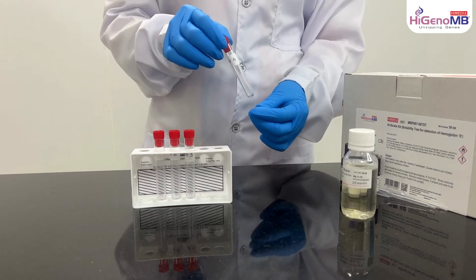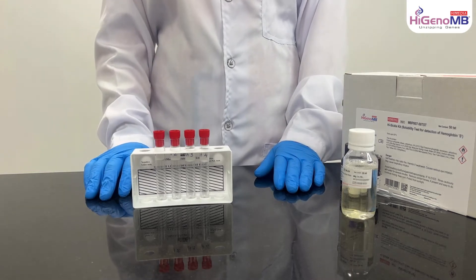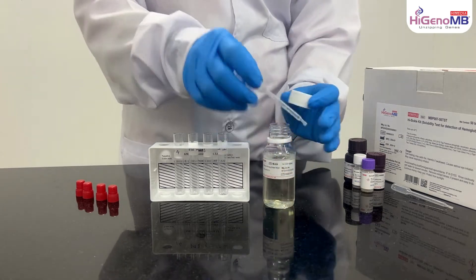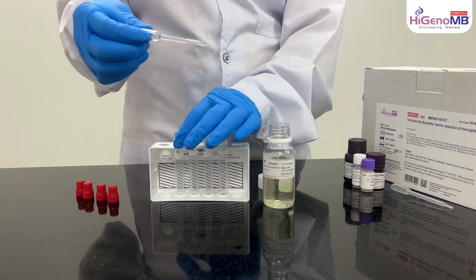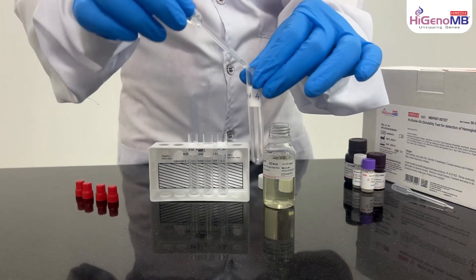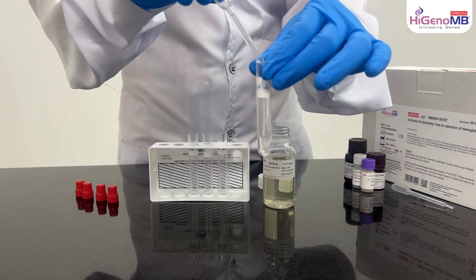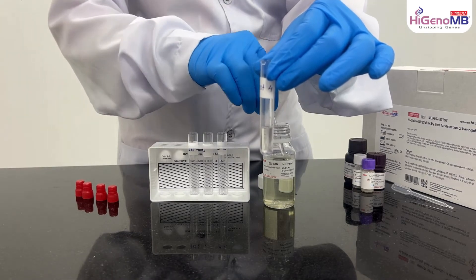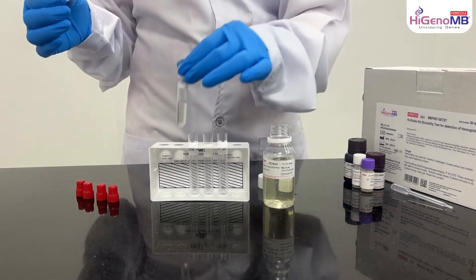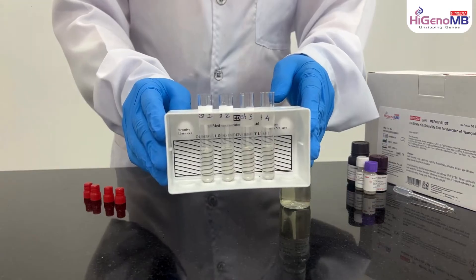To start the solubility experiment, place the test tubes in the test tube stand. By the help of the dropper, take the reagent mix and add to the tube till the mark, which is approximately 2 ml. You can see the black lines.